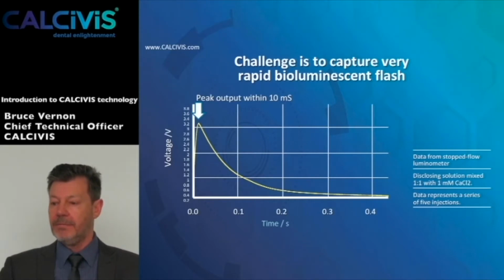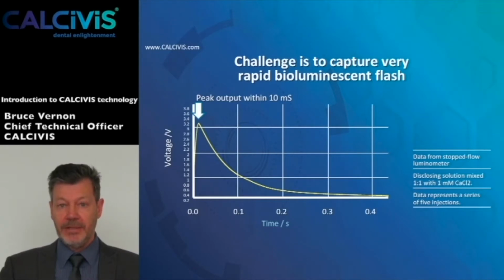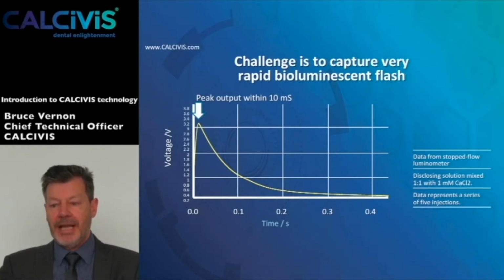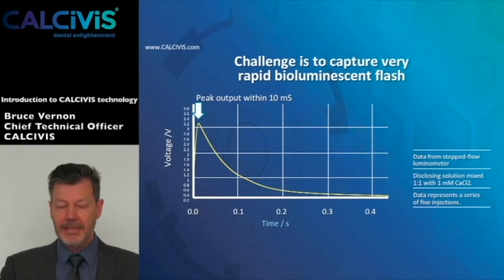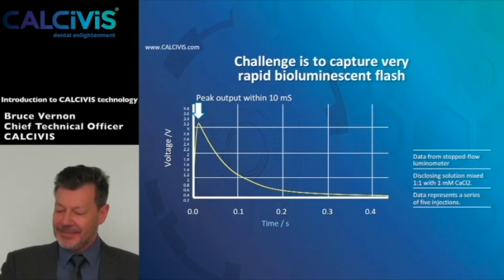And Chris has had issues with this in the past, and also us as well, when we've tried to image teeth. I know Chris had freshly extracted teeth that he would run down to the lab to get into a dark room to get the images performed, and then turns around to the technician and says, "Okay, go." And the technician says, "What do you mean?" He says, "Put the photoprotein on." He says, "I've already done it." "Oh, well, we must have missed it," because it is such a quick reaction.